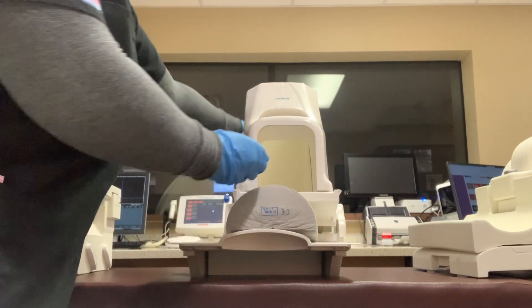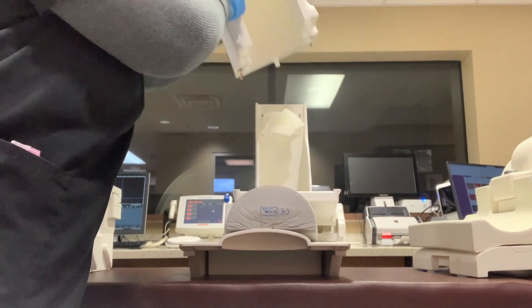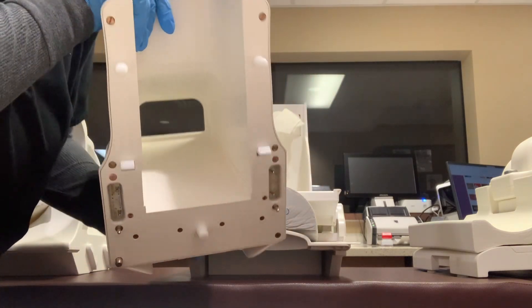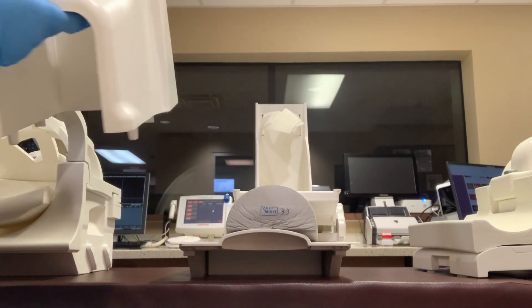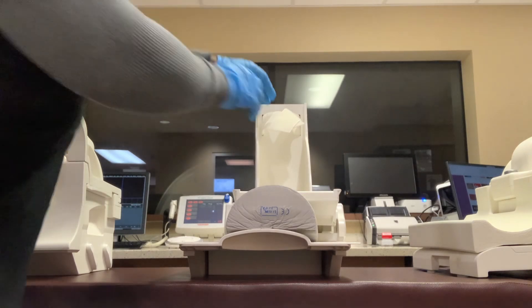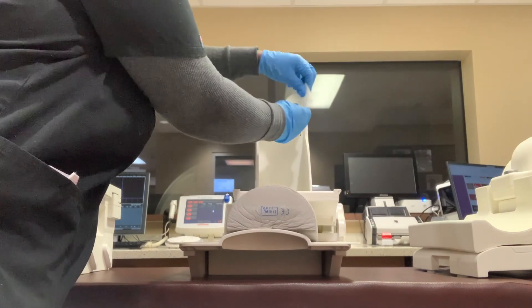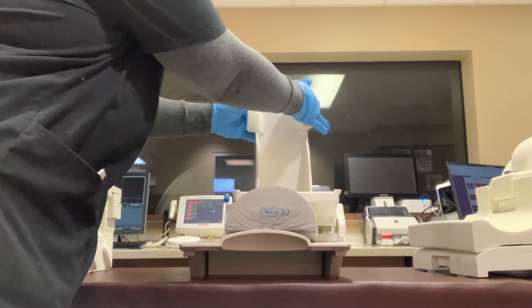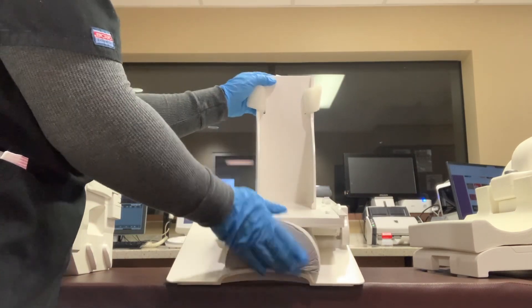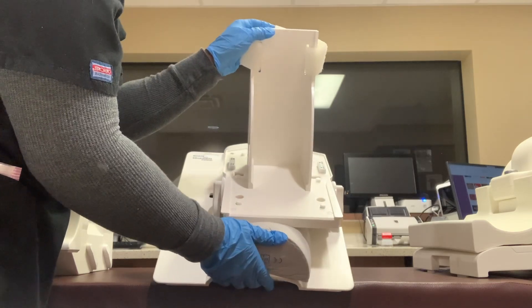We have a dedicated coil for a foot or ankle exam. It's pretty important to make sure that the foot or ankle is properly positioned, so I'm just showing you about the coils. Your foot and ankle goes here and your toes will be pointing upwards.